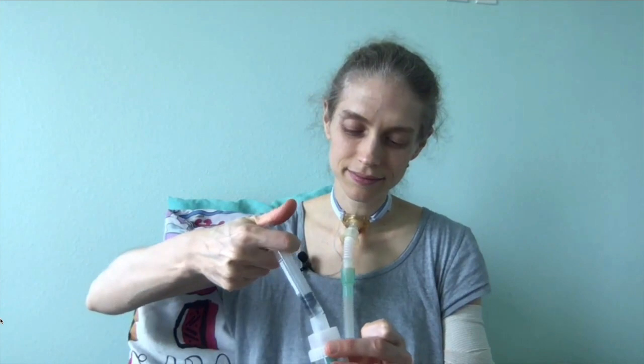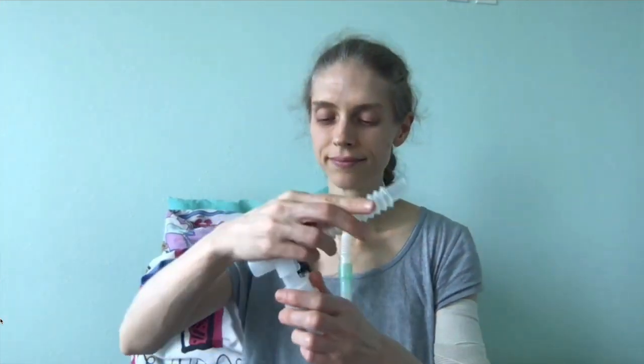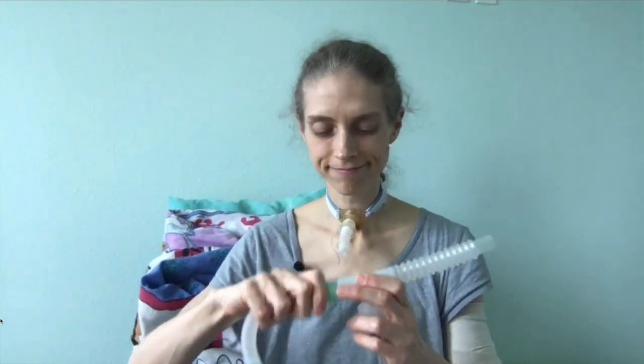Before leaving home, I will run 5 ml of saline through my nebulizer. This helps clear my airways of mucus and also helps rehydrate them. When I return home from the zoo, I will also run another 5 ml of saline through the nebulizer to help rehydrate my airway. I will then disconnect the dry circuit and reconnect to my heated humidifier.